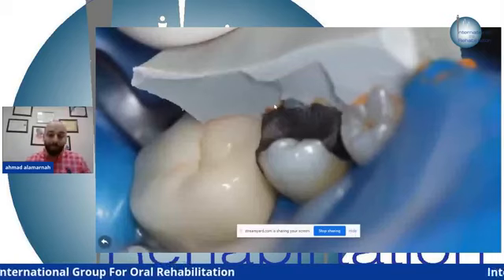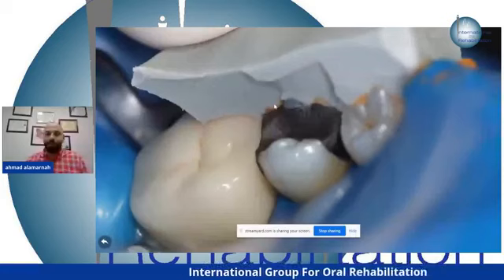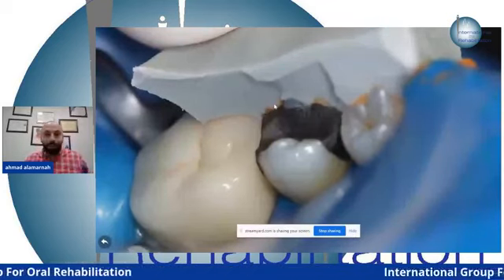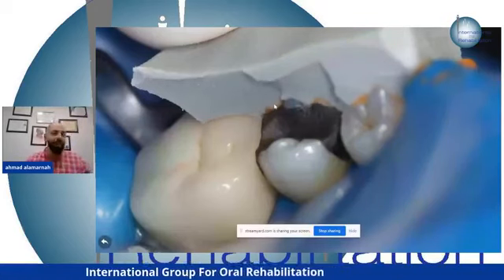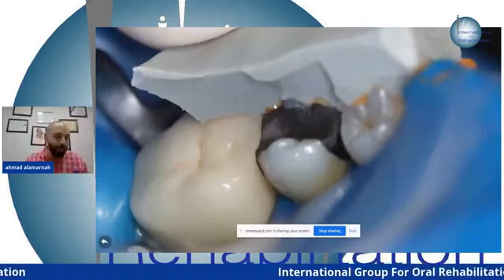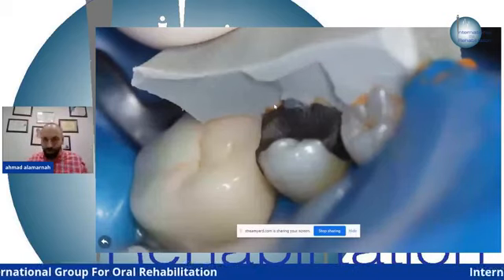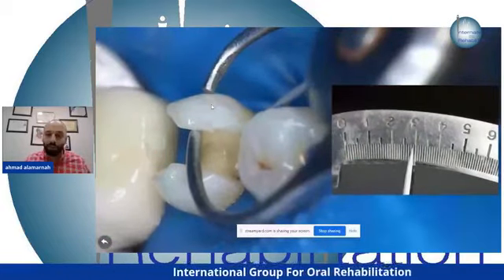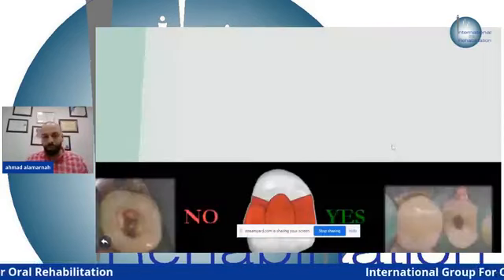And you don't have a matrix system that replicates the same curvature, the same height, the same anatomy of the buccal or the lingual cusp. Okay, so I did this as a precaution. Then after I removed the amalgam restoration, I measured the buccal cusp, and it was like 3 millimeter. It's more than enough.